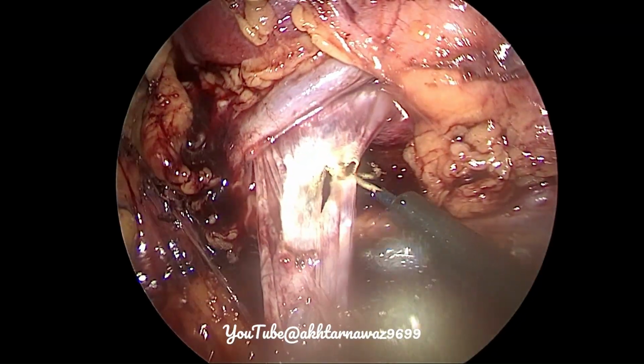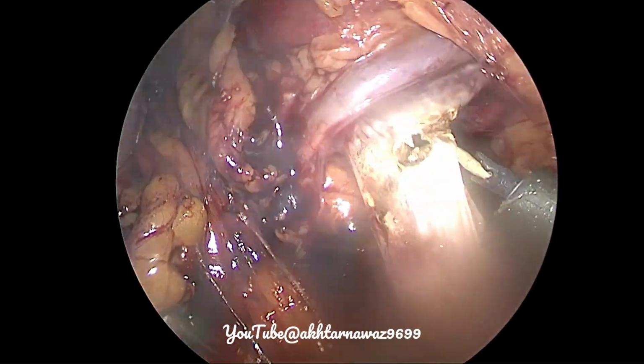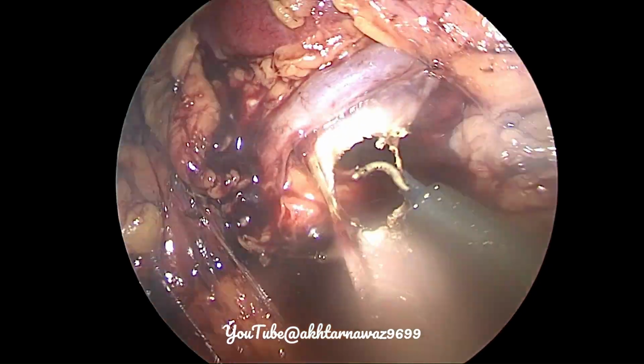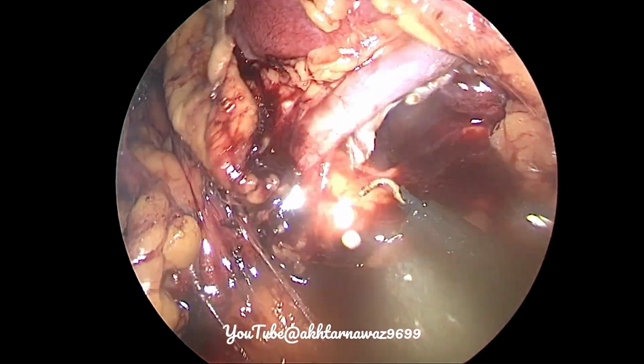We keep the DJS stent for a minimum of 2 to 3 weeks, and then we will just remove it. The stent is just for protection of the pelvic calyceal system. There is no other purpose.